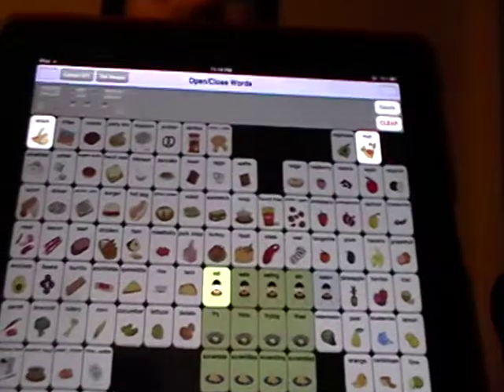So we really hope that this proves to be a wonderful evaluation tool, and that everyone is able to get an idea of exactly how the Speak for Yourself app works, and decide if it's something that is going to work for the individual that you're considering it for. Okay, so we're really excited about it. We're thrilled about the release. We're so glad, and we appreciate your patience.